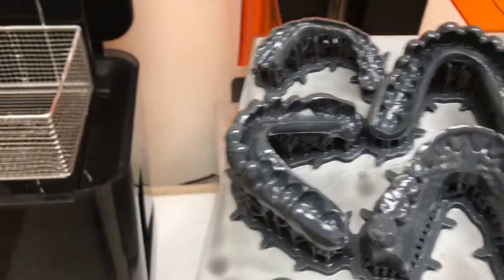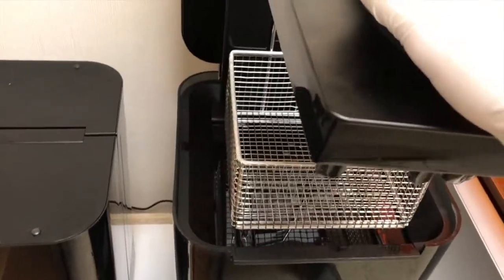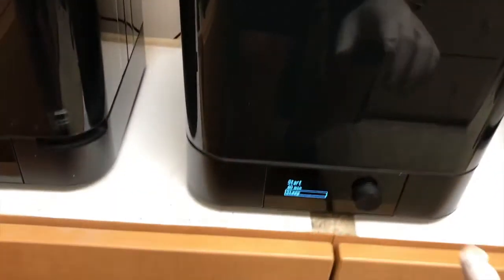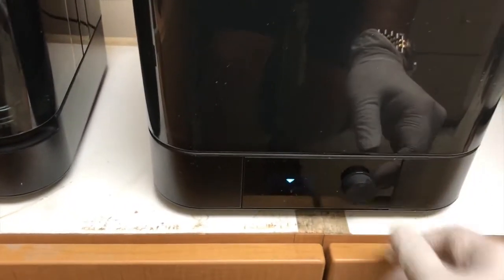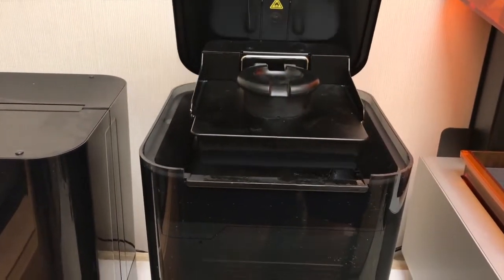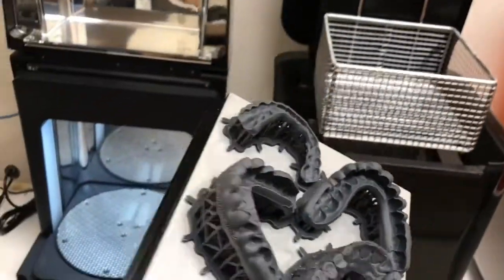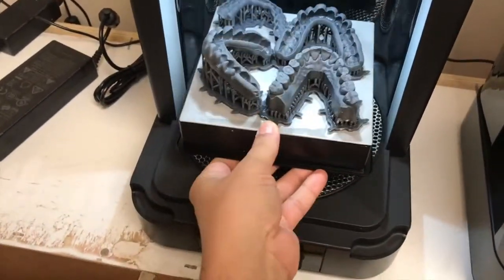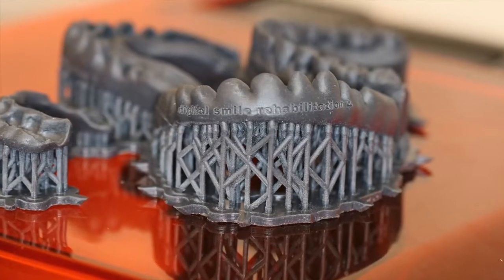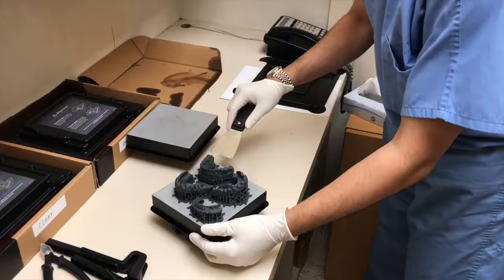This was placed in the Form Wash. I find this to be the most efficient way to clean my prints. And this is the Form Cure. So after letting the alcohol dry, I set it in the curing unit with the table, and this allows for easier removal.